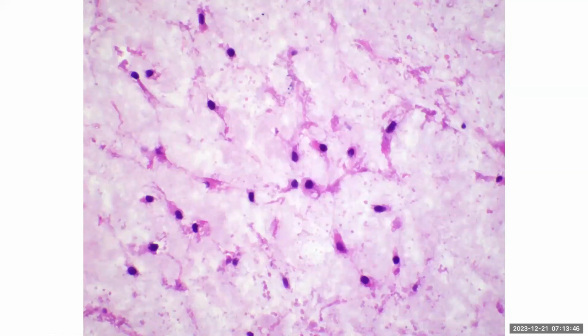Yeah, so high power shows similar characteristics in that individual nuclei are mildly atypical. You know, there's a moderate amount of cytoplasm. The background is the same. So we're going towards a grade 2, like a moderate grade chondrosarcoma here, lack of obvious atypia and mitosis. Next.